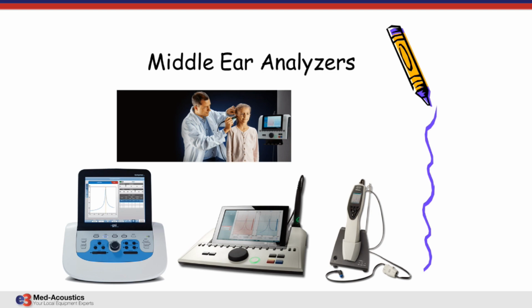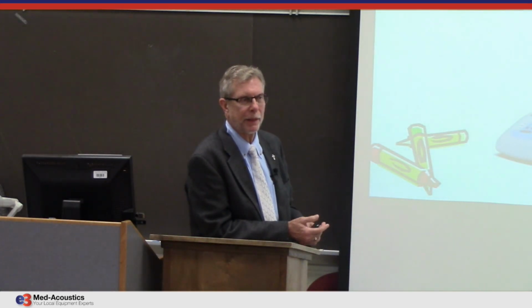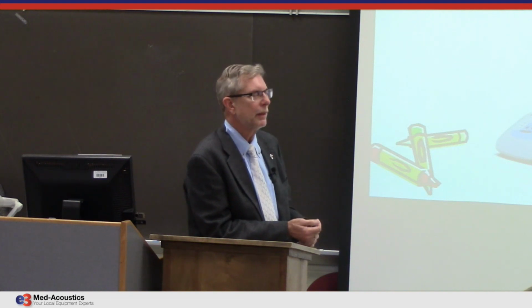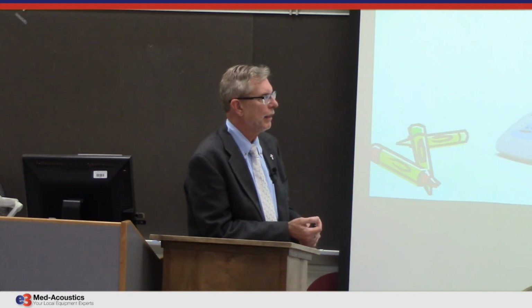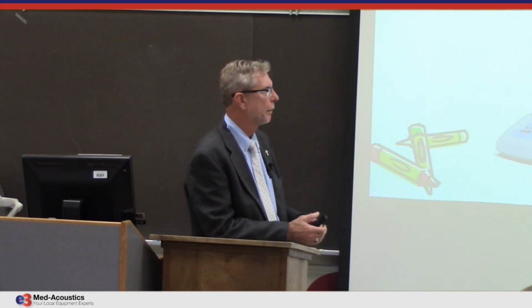Anyway, this can be bought in various different models, some that just do screening tympanometry, some that do like a middle ear analyzer, they do everything. You could have otoacoustic emissions on there, either DPOAE or TEOAE, screening or diagnostic or both, and even have infant screening ABR on there.